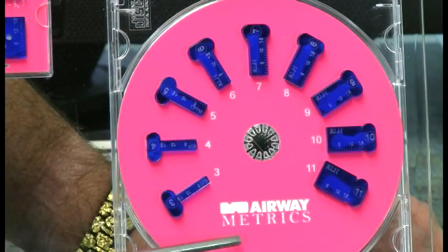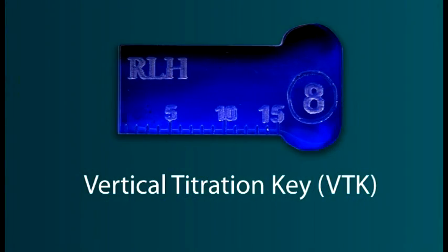They function like a shim, and they are inserted in between the upper and the lower unit of the device. They can also be used as a stop for adding material to the pads if it's indicated that a better or an increased vertical would be more helpful. Now let's zoom in on each one of these components in more detail.